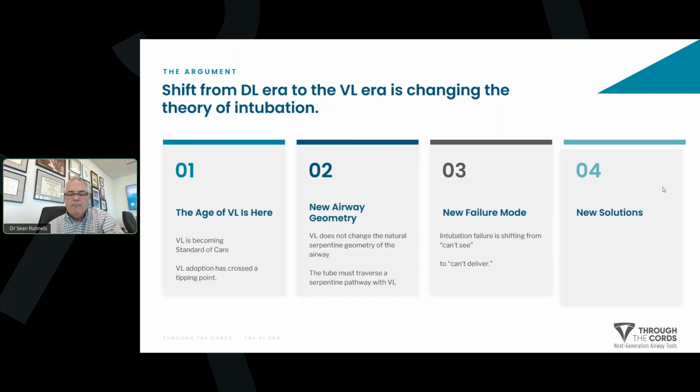And obviously one of the devices I'm bringing to market is a dynamic tracheal access tool. I invented it, so I'm certainly biased. Anything I say about it, you can take with a grain of salt. If I say anything negative about it, you can take that to the bank. I will stick to published literature, and all the publications will be available at the end of the webinar for you to download.